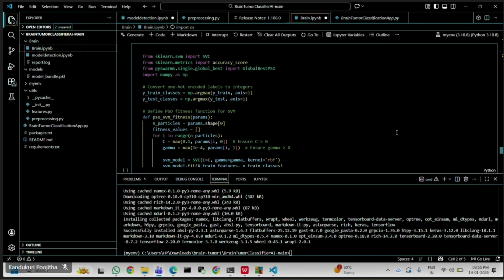These extracted values formed a feature vector for each image. These feature vectors are the input to the classifier, which is SVM in our project.